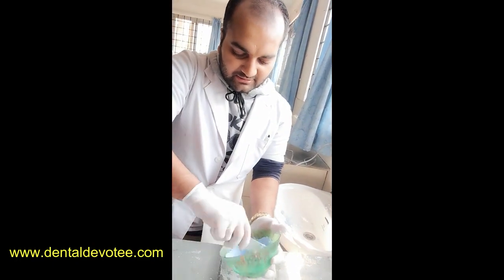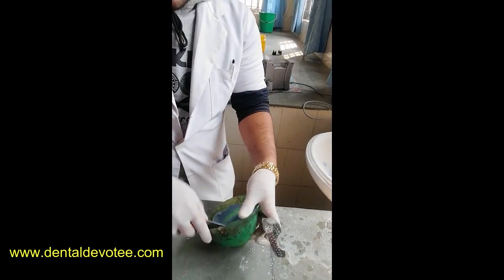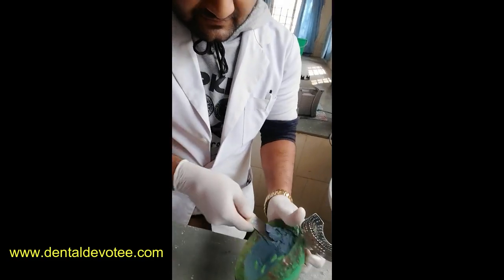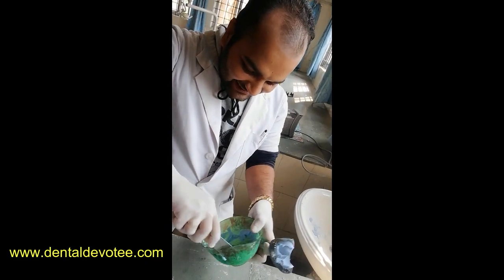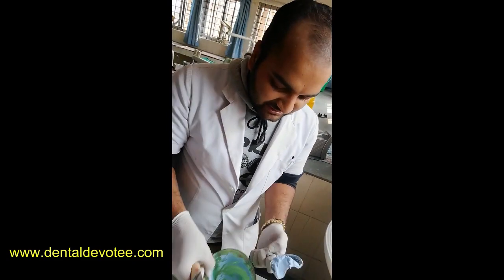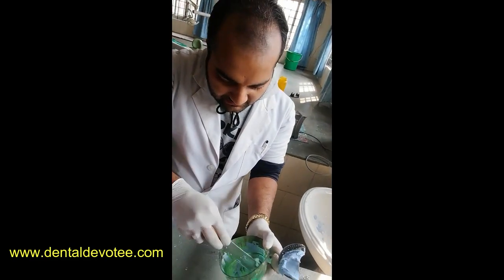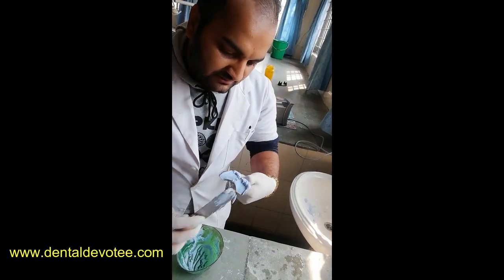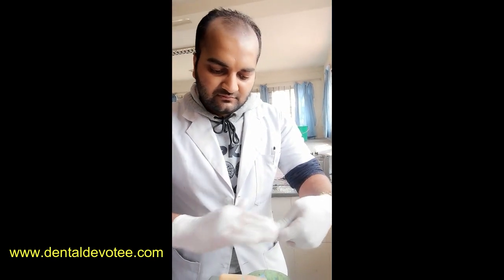I am mixing the Alginate. I am loading the tray. Oh my god, that was really a disaster. The material is a bit deficient. Even if the material is a bit deficient, let's see how it will be.